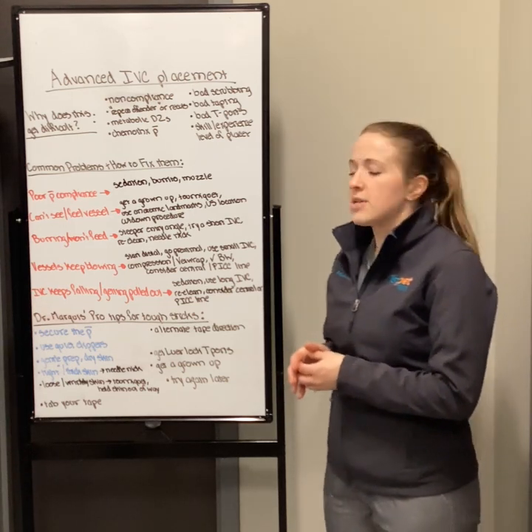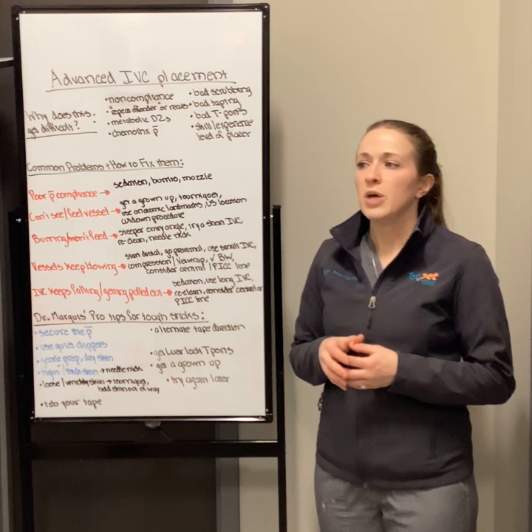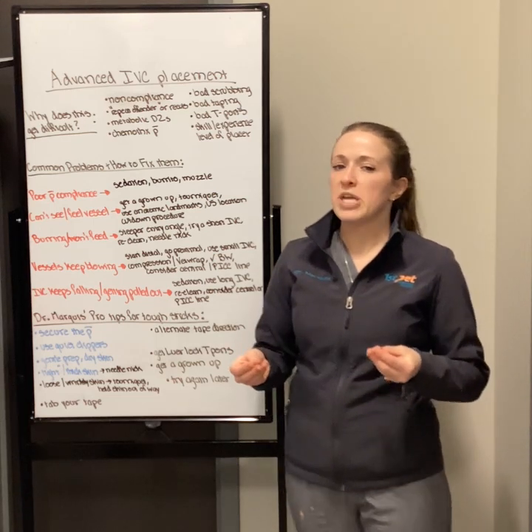Number one is make sure the patient is secured. So have someone who is really good at restraining dogs or cats.